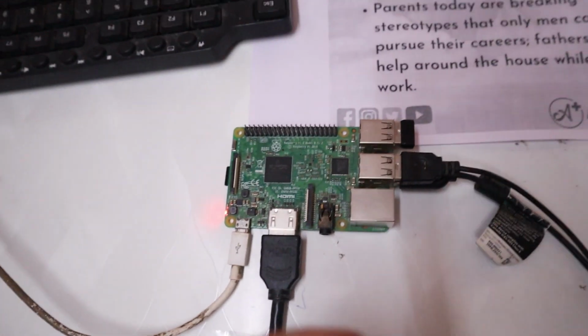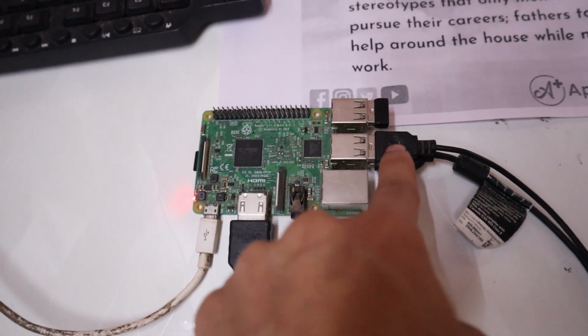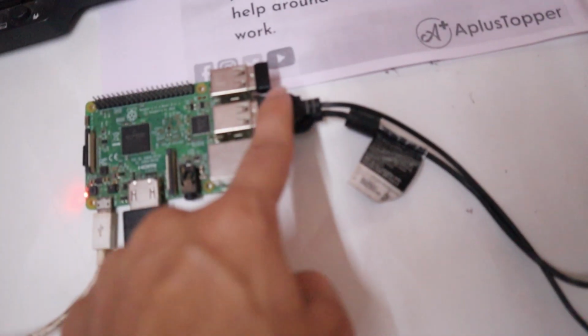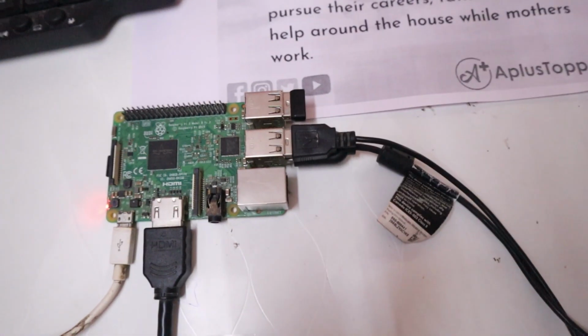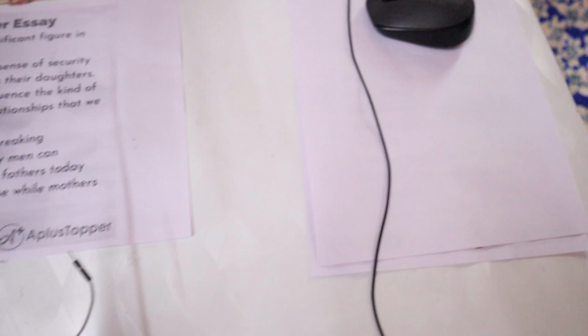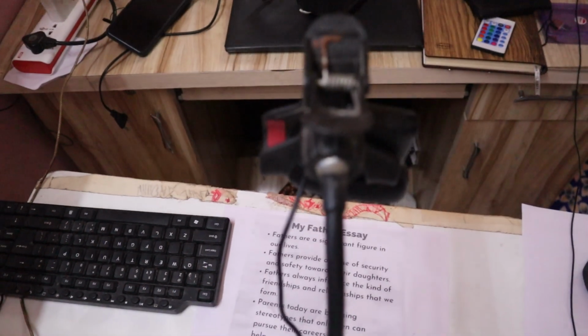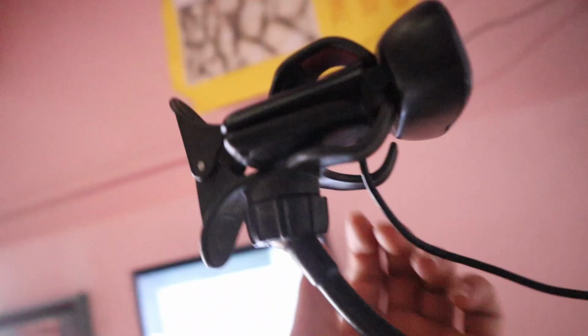Then after that, in the port part you can see we have three USB ports connected. One is for our keyboard, which is used to take the input. Then the second is nothing but the mouse. This is my wireless mouse pin. You can see here is the wireless mouse. And then the next part is we require one camera, which is attached here. You can see the camera, it is attached here. So this is my camera. You can also purchase this.